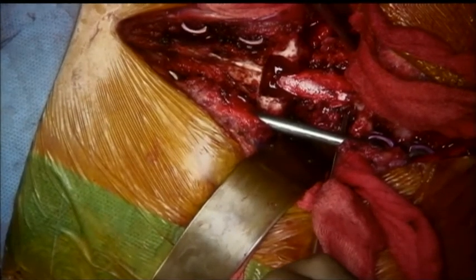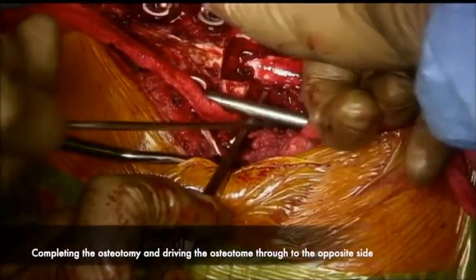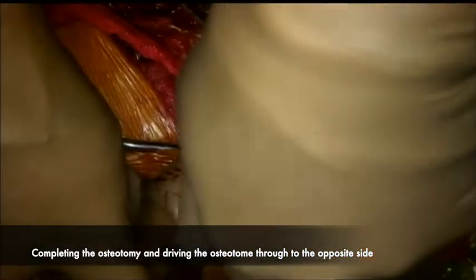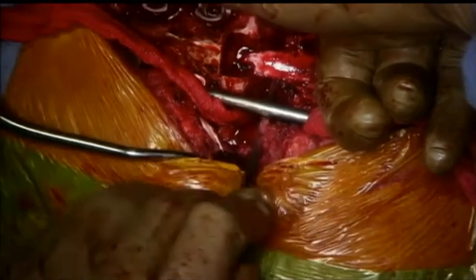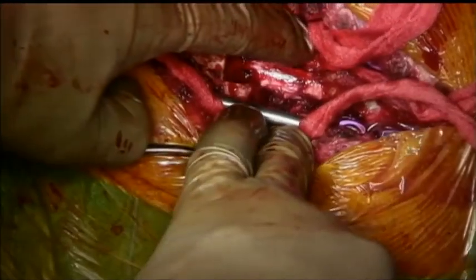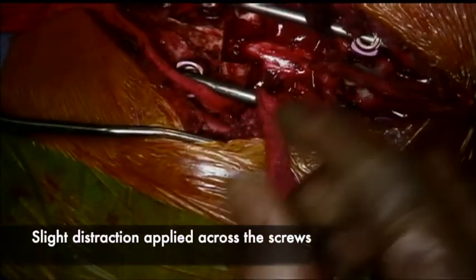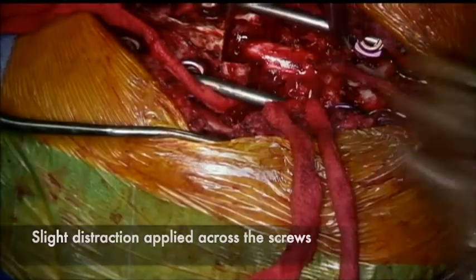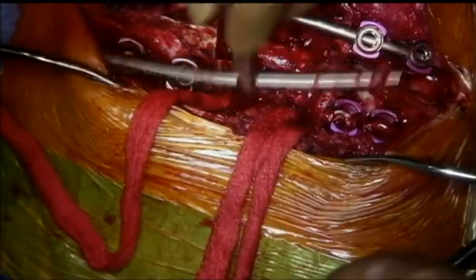Slowly alternating between left and right side, most of the vertebral body can be cut. To break the most anterior part of the vertebral body, a finger is placed on the opposite side and the osteotome is driven in until it touches the finger, confirming the cut has been completed through and through. A similar manoeuvre is done at the upper level. Once the vertebral body is reasonably mobile, a slight distraction is applied across the screws to help extract the tumor-laden vertebral body.